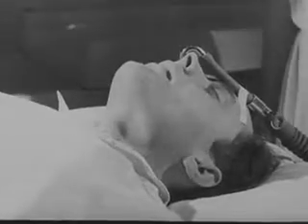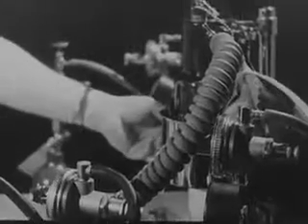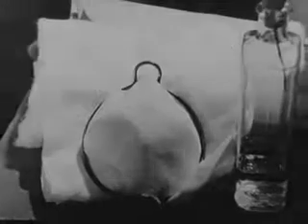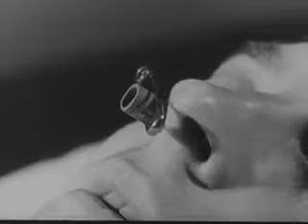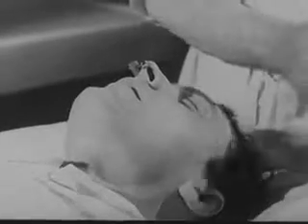Anesthesia can be maintained as before by using an anesthetic machine, or by means of an ordinary mask and ether drop bottle when the anaesthetist has free access to the patient's face. In this case, the metal connection may be discarded and the endotracheal tube is transfixed by a safety pin to prevent its disappearing down the nose.